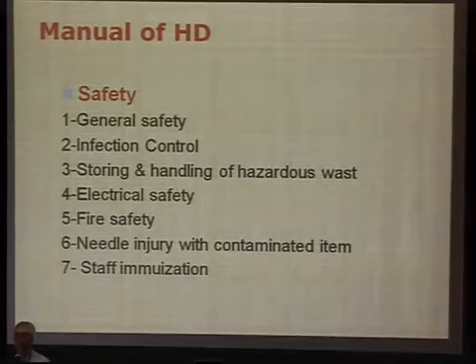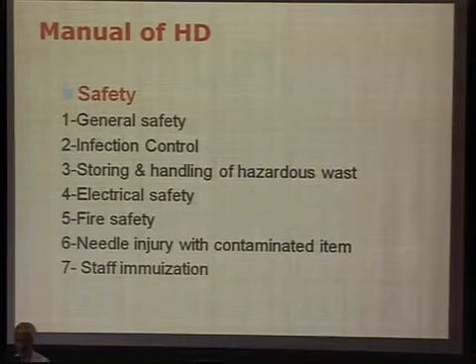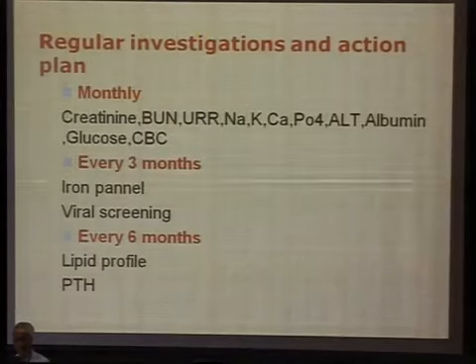Also, regarding safety: general safety, infection control, storing and handling of hazardous waste, electrical safety, fire safety, needle injury with contaminated items, and immunization. You must have a manual covering all these aspects of hemodialysis. Housekeeping, daily, weekly, and monthly, is very important to be covered in the manual.